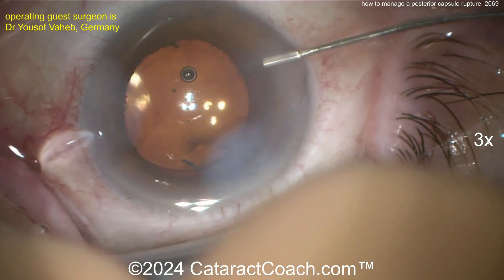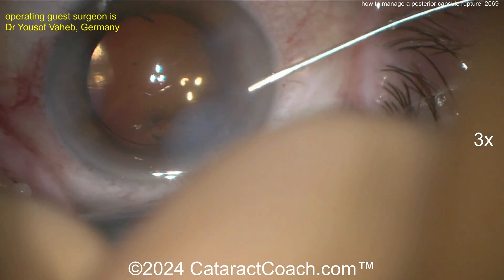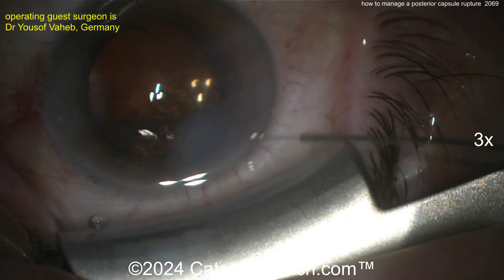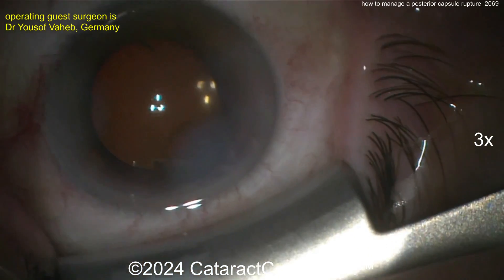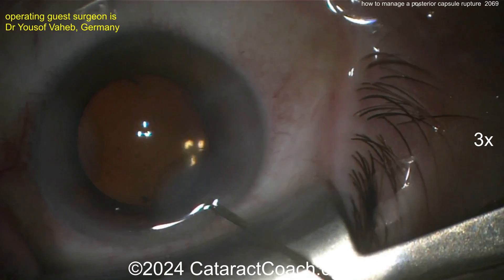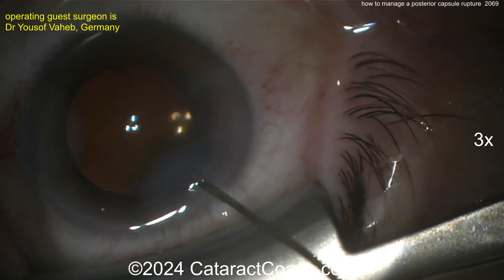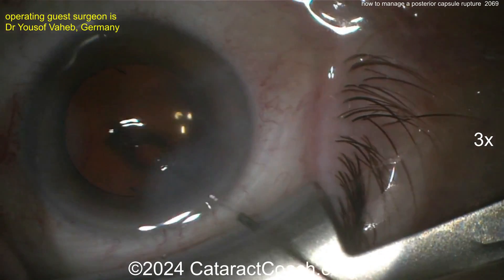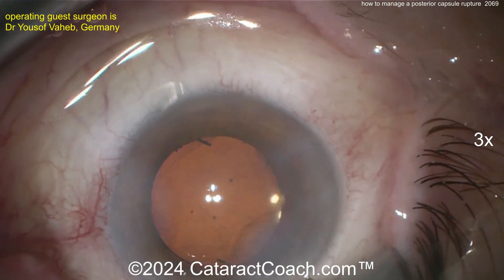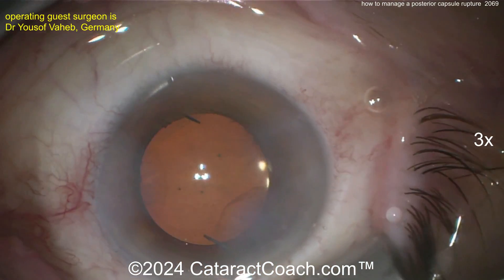For the main incision, I'd probably want to put a nylon suture in just for good measure — I don't want the AC to collapse in the post-op period. If the patient touches the eye and the AC collapses, you will get vitreous prolapse because there's no central posterior capsule anymore. Really nicely done in this case. This is going to happen to all of us, so you need to know how to perform a good anterior vitrectomy and deal with posterior capsule rupture.